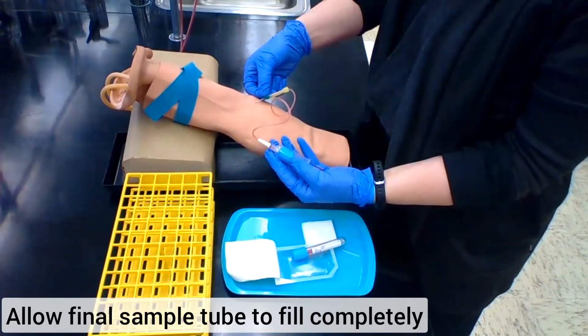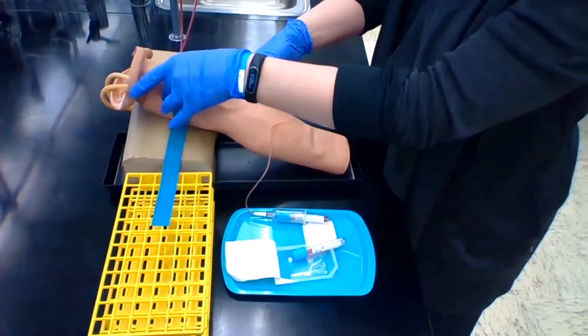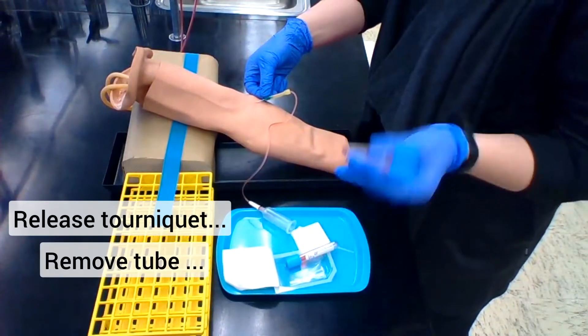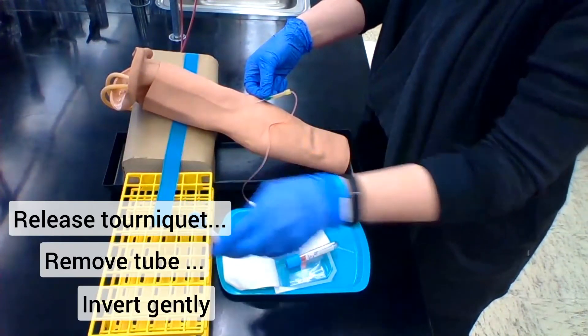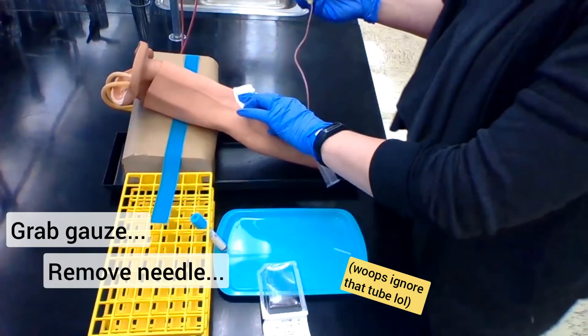Allow your final tube to finish filling completely and then you're going to do what you did with the regular vacutainer system. Release the tourniquet, remove the tube from the holder and gently invert it, and then take your gauze, shield the patient, and pull out that needle.